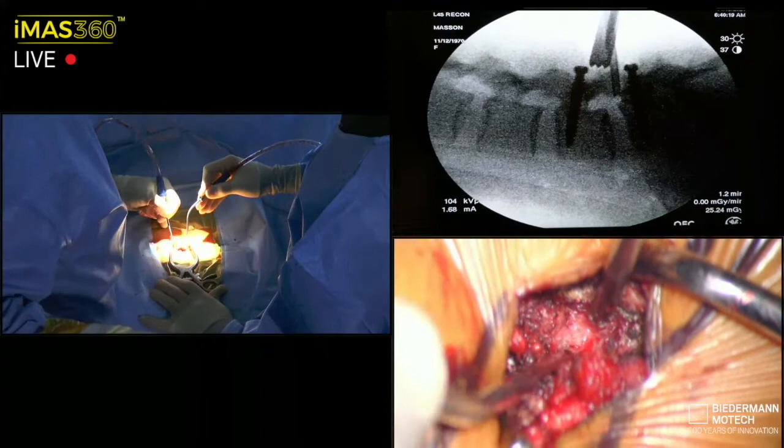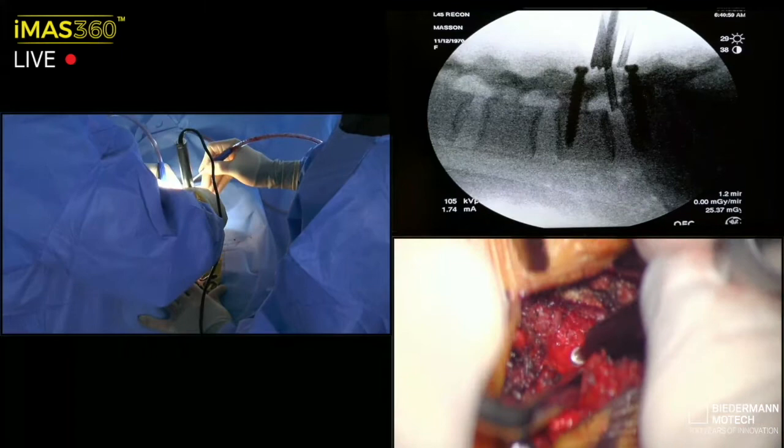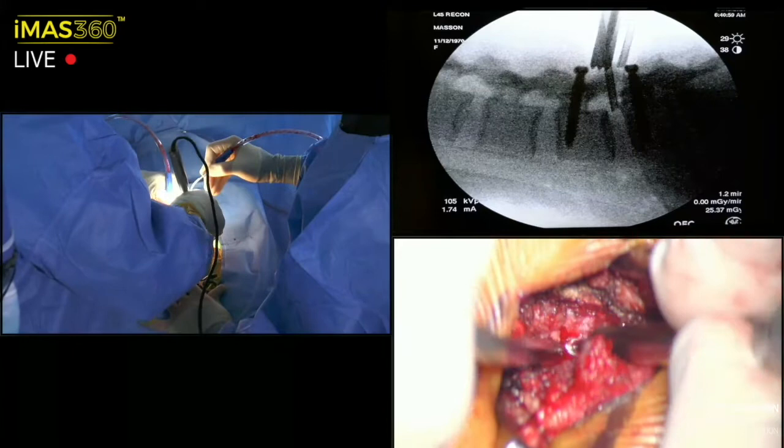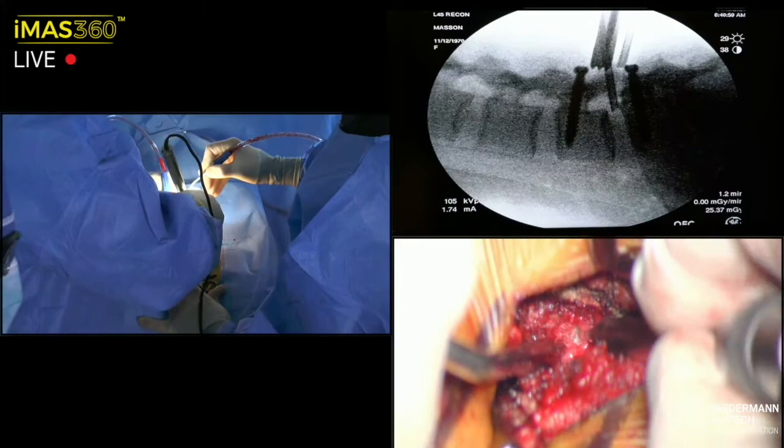Get in there. As I look here, you can see I'm in lateral fluoro, a little below the posterior line, but I'm a little lateral to this bone resection, so I'm going to continue that bone work more medially. That'll get us up to the top of the cliff, so I won't be overhanging the lateral disc. That medial facet is loose as well. Okay, so let's look here.